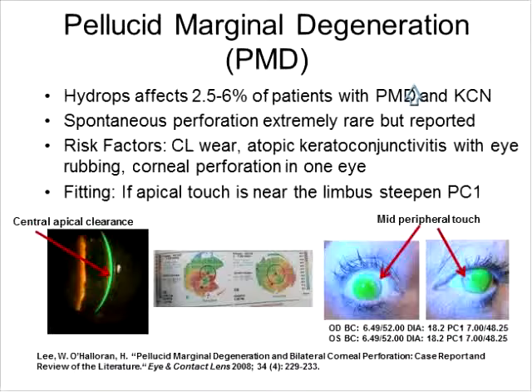Lynette? I agree with both Dr. Barnett and Dr. Toabe. If you're really battling the debris problem, dropping down the vault a little bit can make a huge difference. But if you're not having excessive exchange, then I could make the statement it doesn't matter.